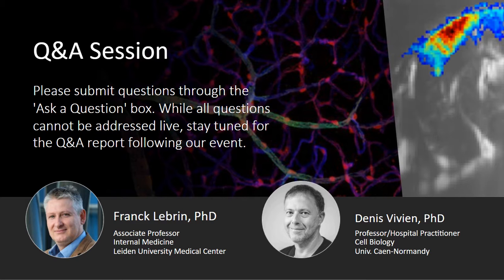Well, I think the resolution is the key there. In preclinical models, of course, we can use photonic imaging, and then we have access almost to the cell level, right? So we can really see what the consequences of cellular defects associated with vascular dysfunctions are.